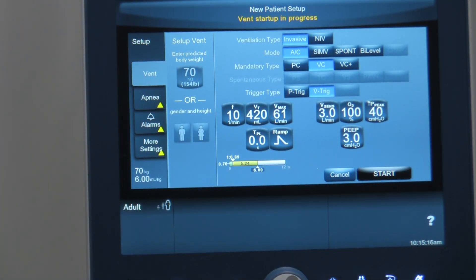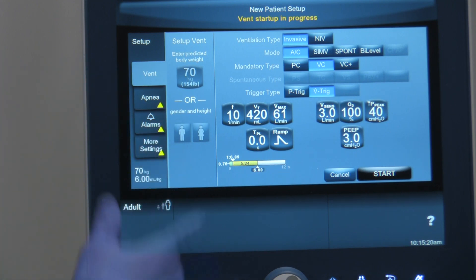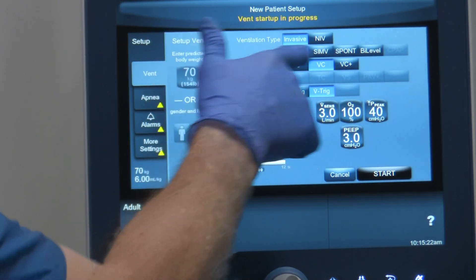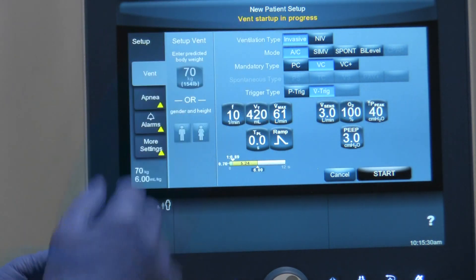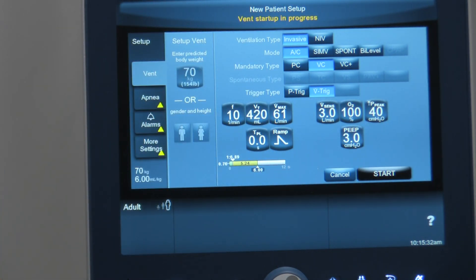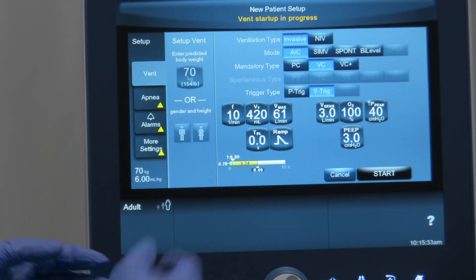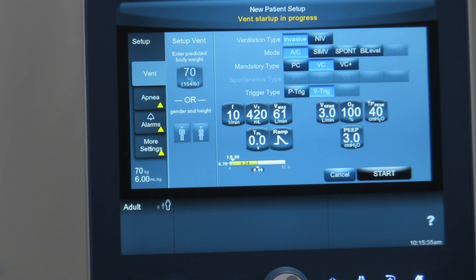Now when we're in invasive, some of the things it allows us to choose next is the mode. The mode selections on the PB980 are assist control, SIMV — which is synchronous intermittent mandatory ventilation — spontaneous mode, and bi-level. So we're going to choose assist control as our basic mode to start with.